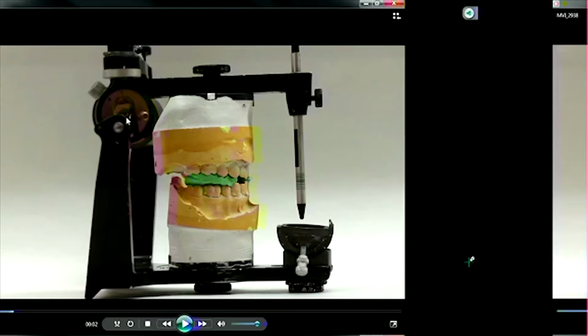We're passing that articulator around so you guys can see, right now this is very steep. So the point is you're going to alter or toggle the inclination here until the teeth fully seat into the bite record.